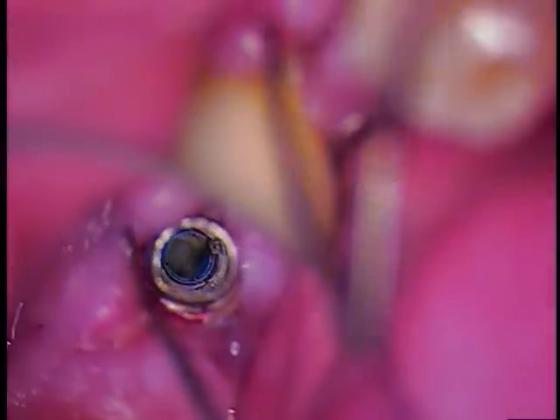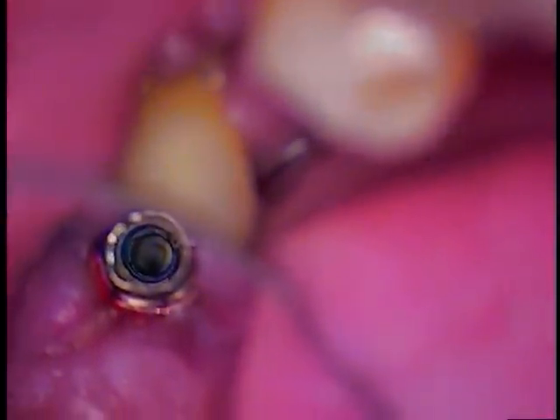If I were to measure the length internally — and we know it's color code blue — this probe goes down to the fracture. That looks like we're right at 3, 6, 9, 12 — about 12 millimeters in depth. So we've got about 5 millimeters going down at the top, then another 12. That gives us a 5-minus-12 — a 7 millimeter length from the top of the fixture itself until there's a fracture.